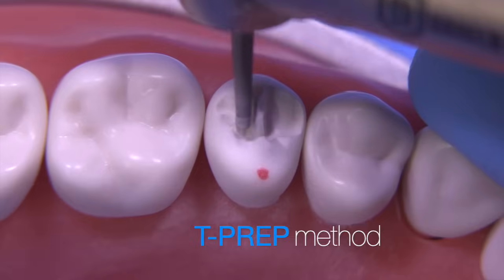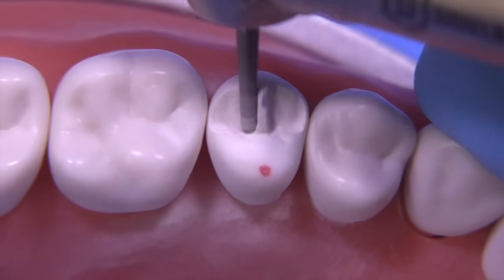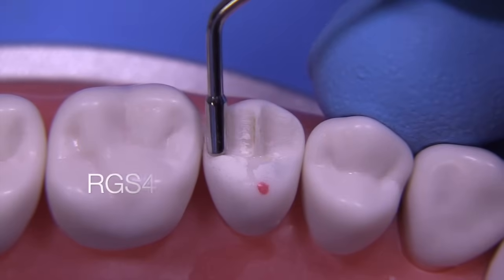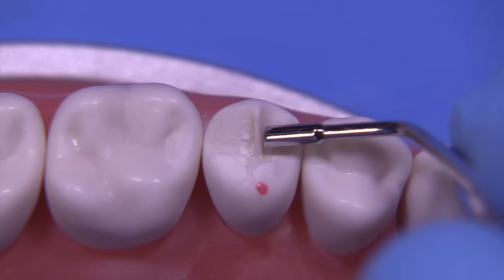This is the T-prep variation. What we're going to do with this variation is leave a small portion in the middle, which will serve to remind us how much reduction we've actually made during the preparation. Once again, checking frequently with the RGS4.